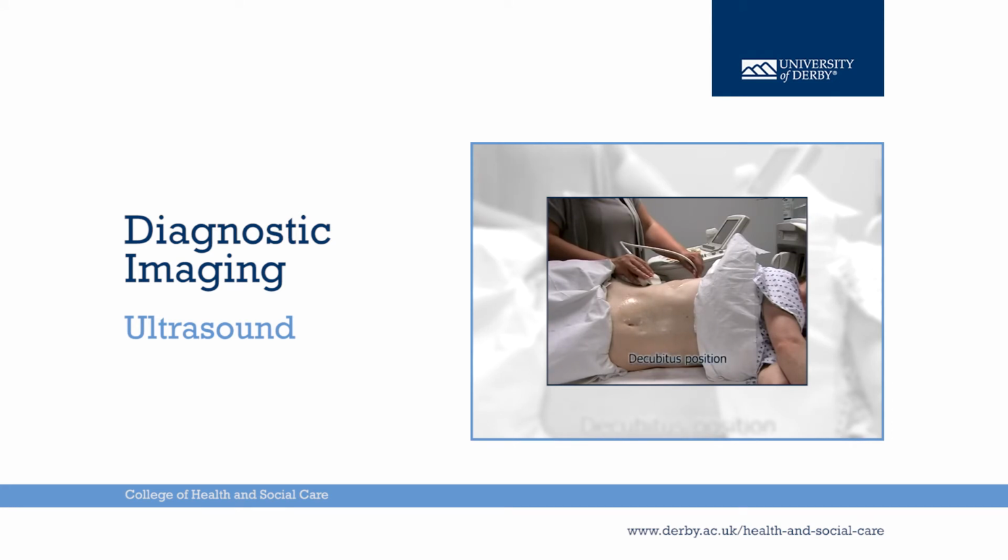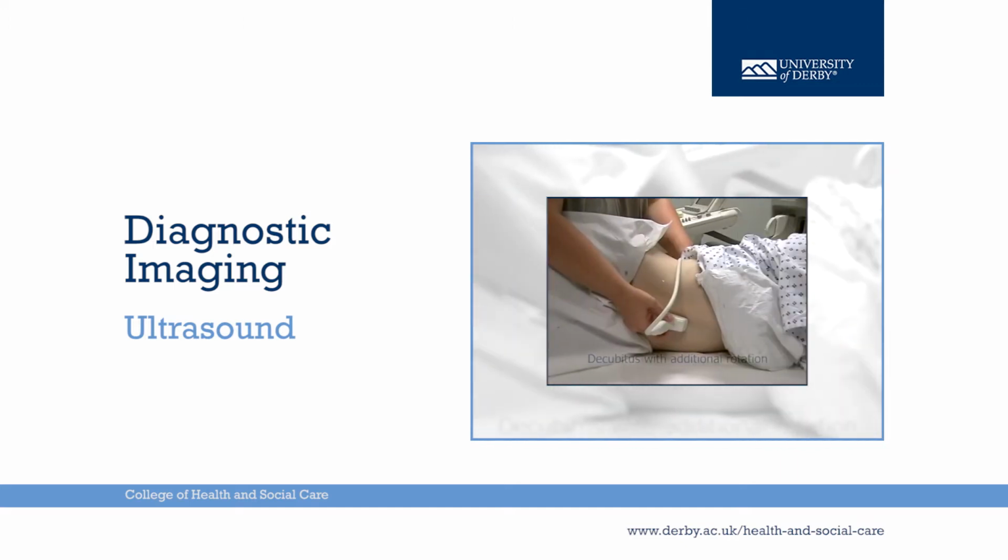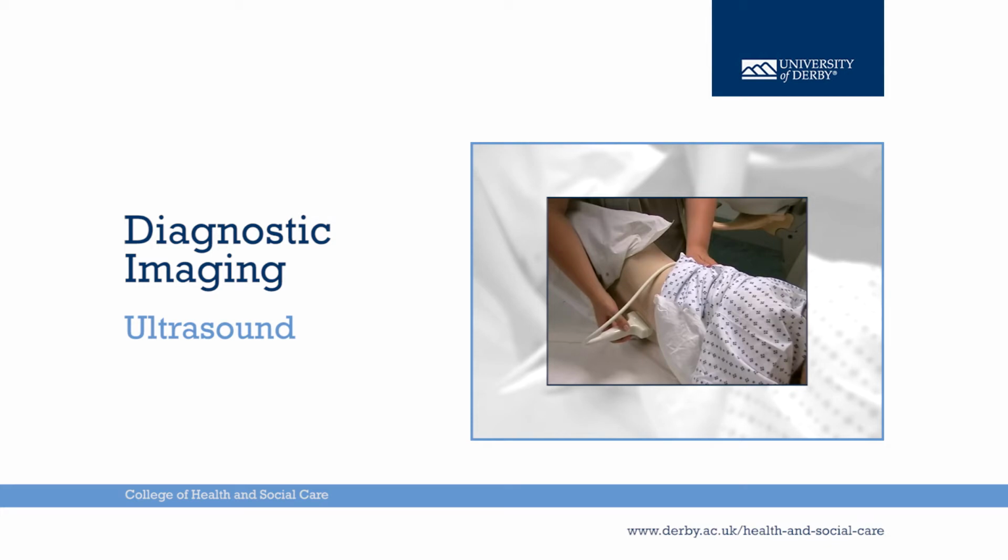Decubitus position. The patient is rotated to 90 degrees from the supine position. This position helps to move the bowel and bowel gas away from the region being scanned. Decubitus with additional forward rotation of the patient. This position is used to observe movement of calculi and biliary sludge within the gallbladder lumen.